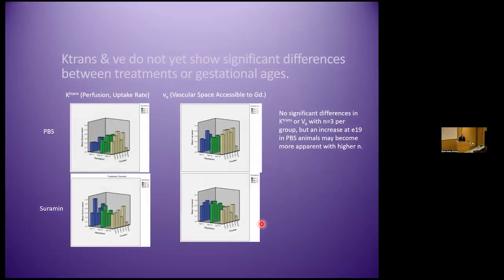And the reason I bring up the modeling is because the modeling is not only influenced by noise, but unfortunately, different groups have different assumptions, different algorithms. So it's not really standardized. And that's probably the only downside of dynamic contrast enhanced MRIs. They're working on that at the main conference. So at the International Society of Magnetic Resonance in Medicine, there is a study section that's working on standardization, but there's still a ways to go.